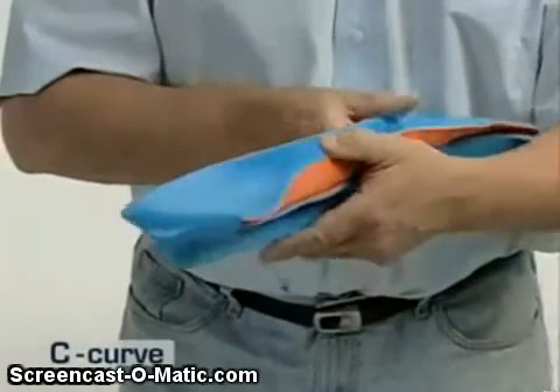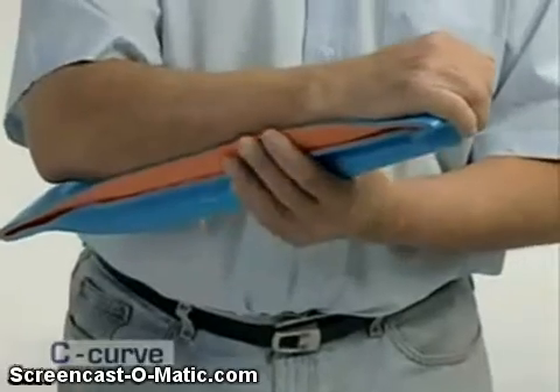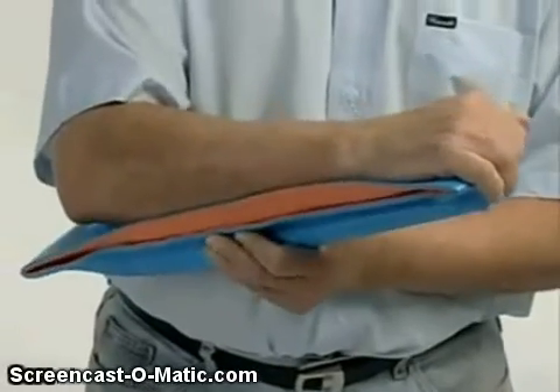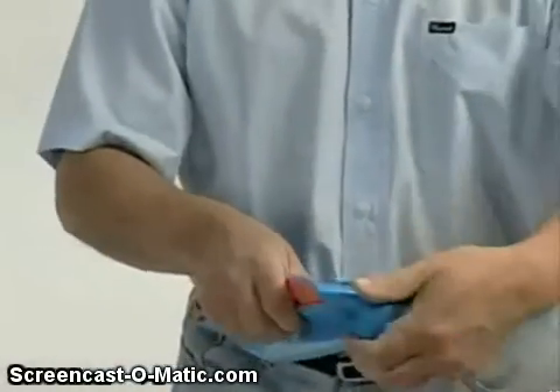Form a C-Curve in the flat surface of the splint. Then, using your own right or left wrist and forearm as a template, shape the splint to fit.